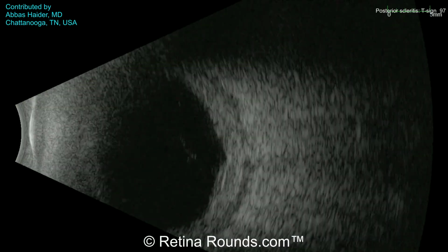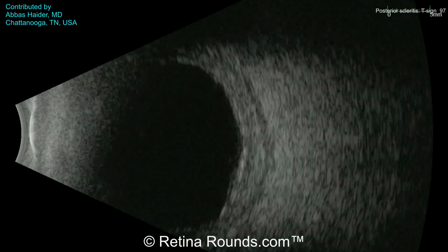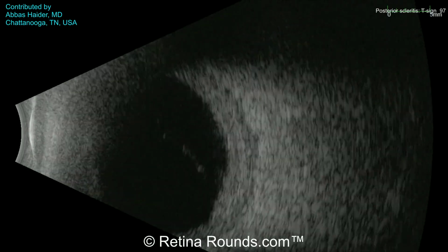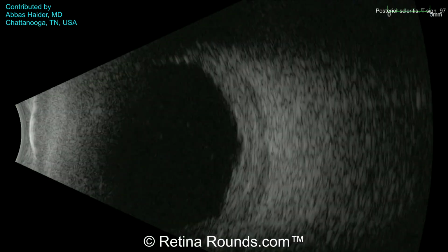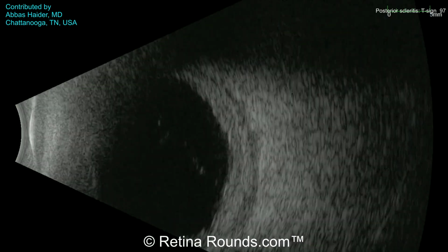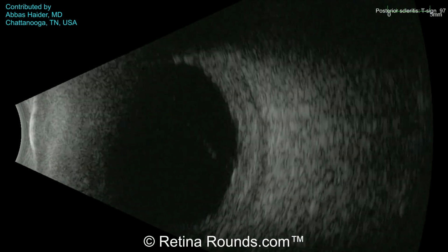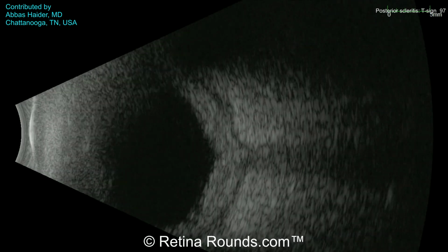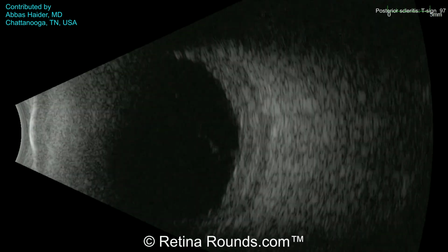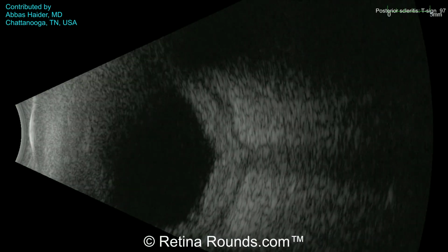Well, in cases of posterior scleritis, the inflammation can result in fluid accumulation overlying the sclera. And in fact, that inflammation can result in fluid accumulation not only over the surface of the sclera, but also in the adjacent choroid. And you can see that in this ultrasound, the choroid appears to be much thicker than normal. And while choroidal thickening can be seen in a variety of conditions, this combination of a T-sign and choroidal thickening is highly suggestive of posterior scleritis.